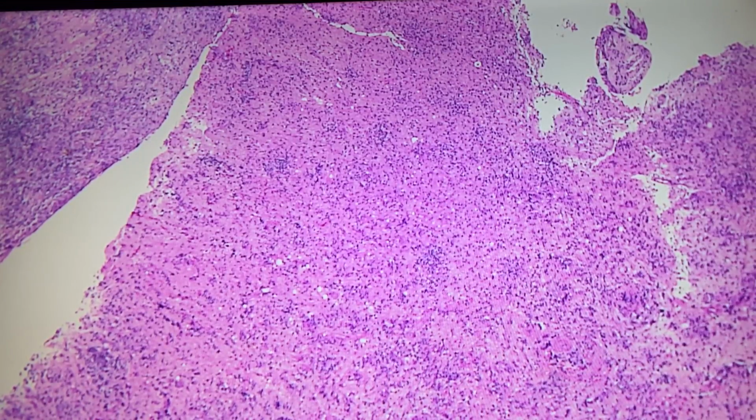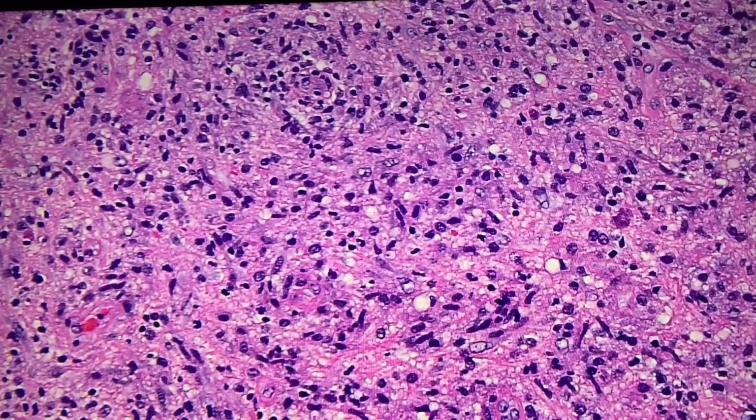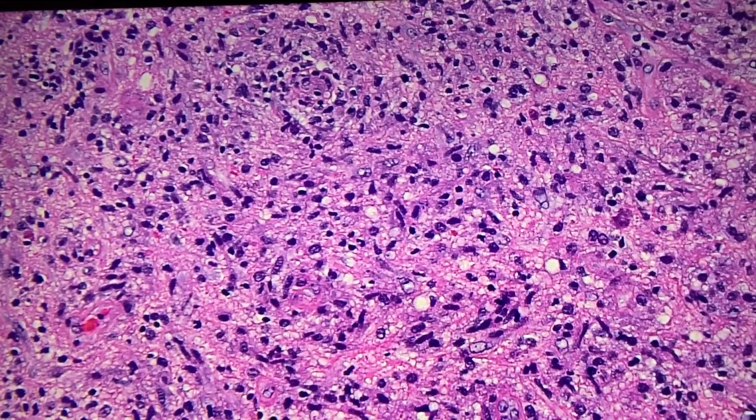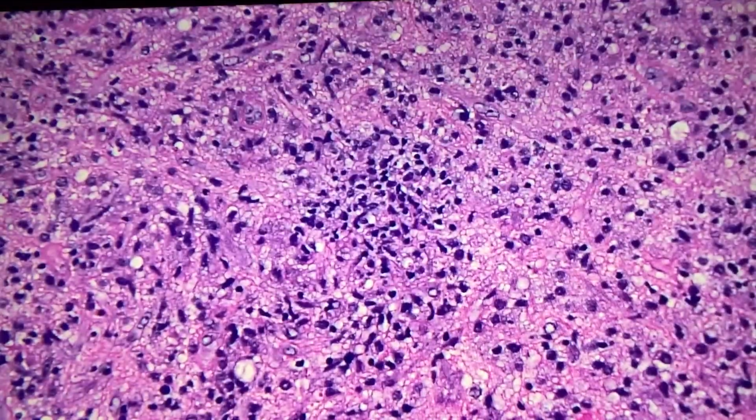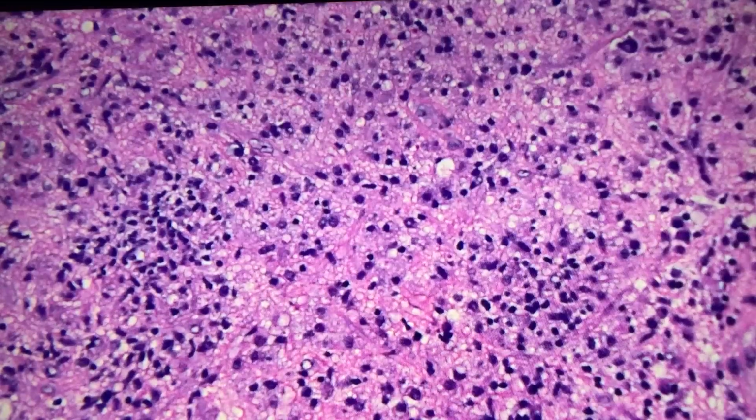While there are some lighter, pinker areas, I wouldn't go as far as necrosis yet. I'd keep looking, but yeah, that looks like inflammation, plenty of lymphs in there, some histiocytes. Very good. So we see a lot of histiocytes and a lot of lymphocytes. What about those atypical cells you were seeing?